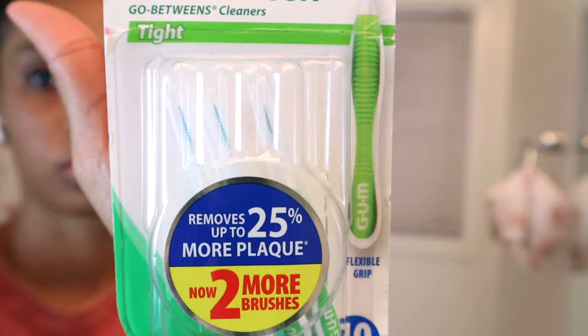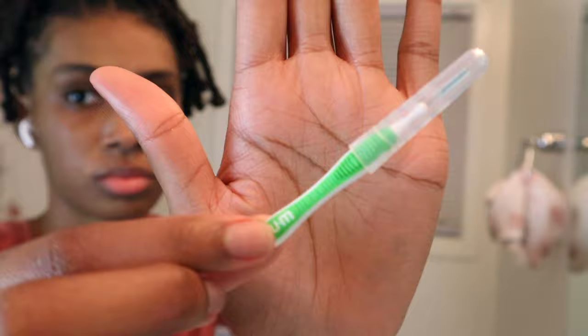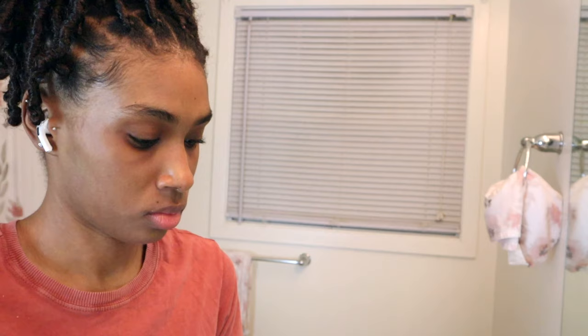Now I'm just going to take these GUM Proxabrushes — these little brushes. I'm going to put a little bit of toothpaste on one and use them to clean my brackets. These are originally designed to go in between your teeth to clean any bacteria hiding between your gums, and I use them for that reason too, but they're also really good for cleaning the sides of your brackets where your toothbrush cannot reach. So I'm just going to put a little bit of toothpaste on it and go in between and clean my brackets.